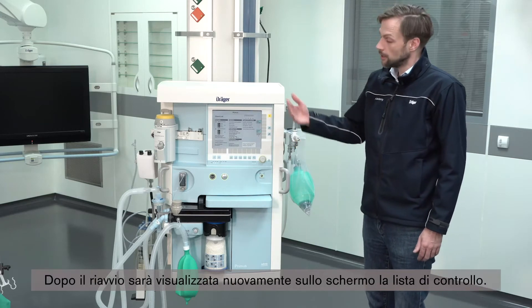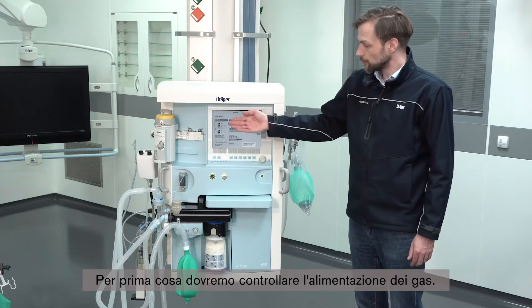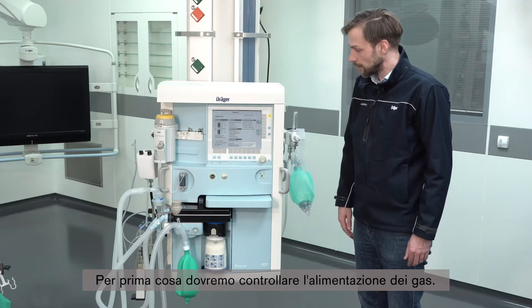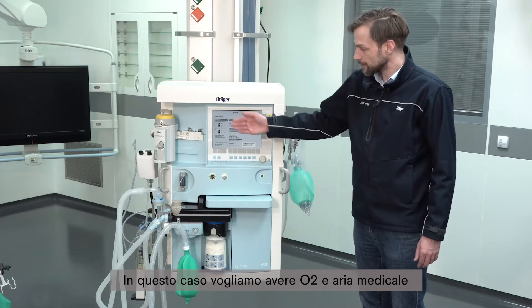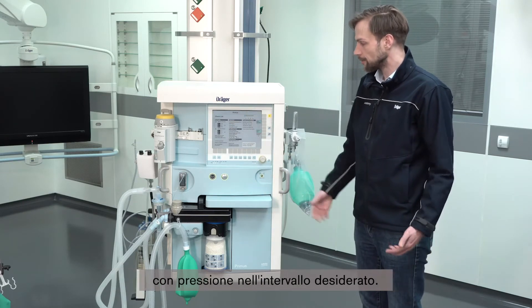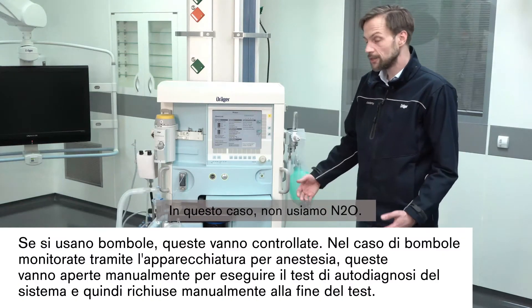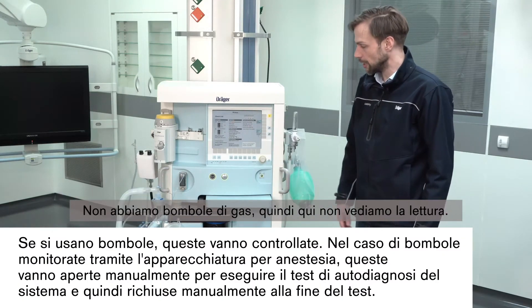After reboot the checklist appears again on the screen. First we should check if the gas supply is proper. Here we want to have at least O2 and medical air, and the pressure is in the range. N2O we don't use here, and we also don't have cylinders, so we see no reading there.